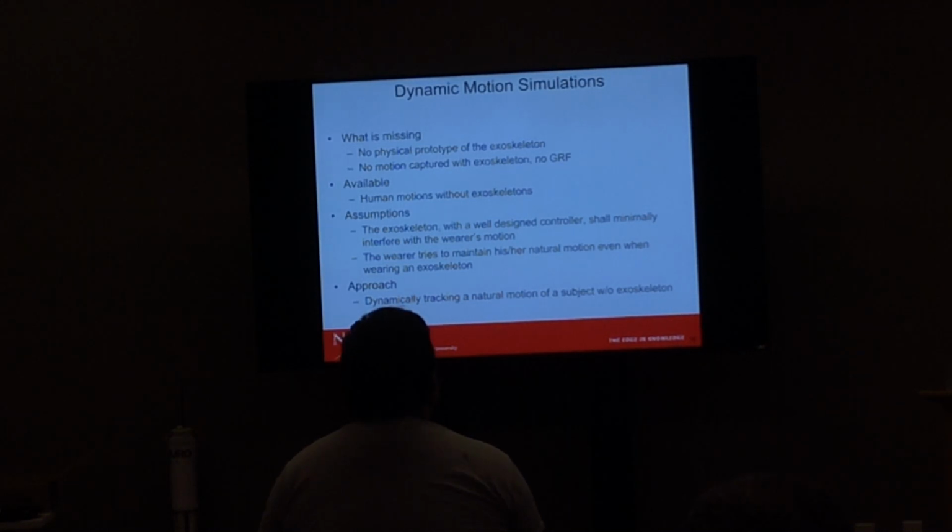But the problem is I don't really have access to the device. So we don't have an exoskeleton device, and we don't have the motion capture of this device working with the human. But it's still possible to simulate that.